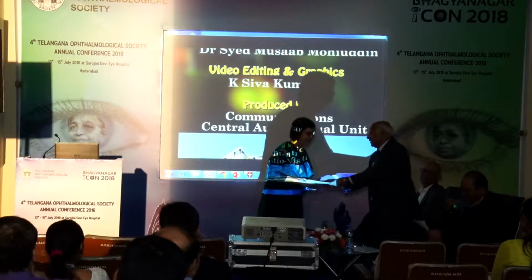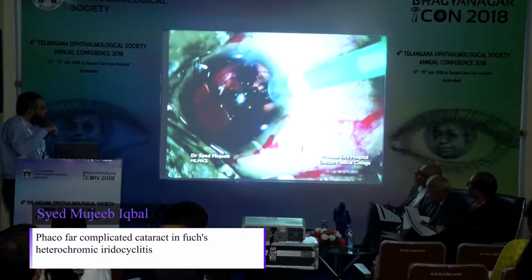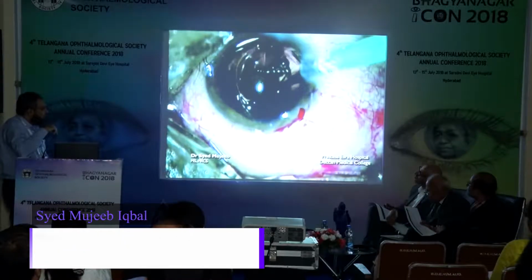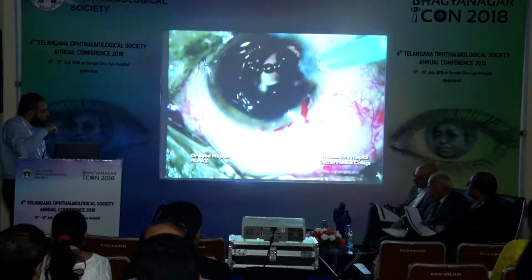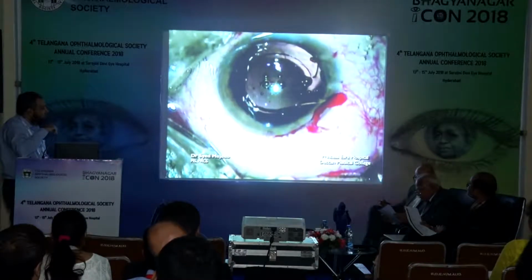We all enjoyed it. Caution that the PC should not move anteriorly. Foldable lens is implanted into the posterior chamber, into the bag.